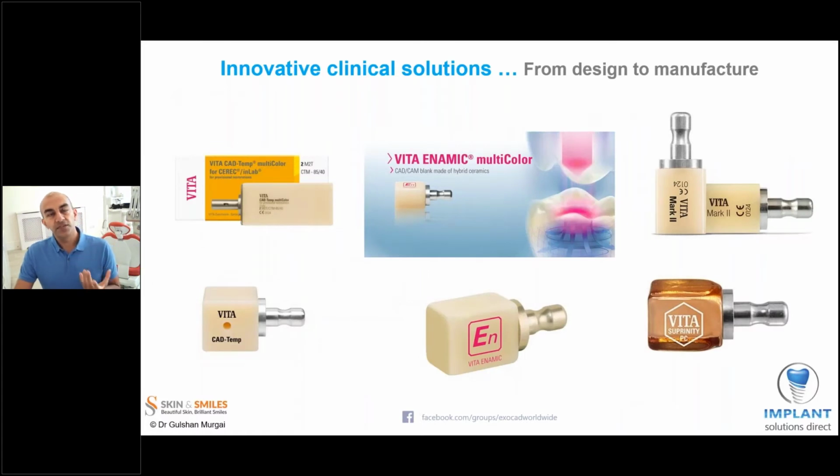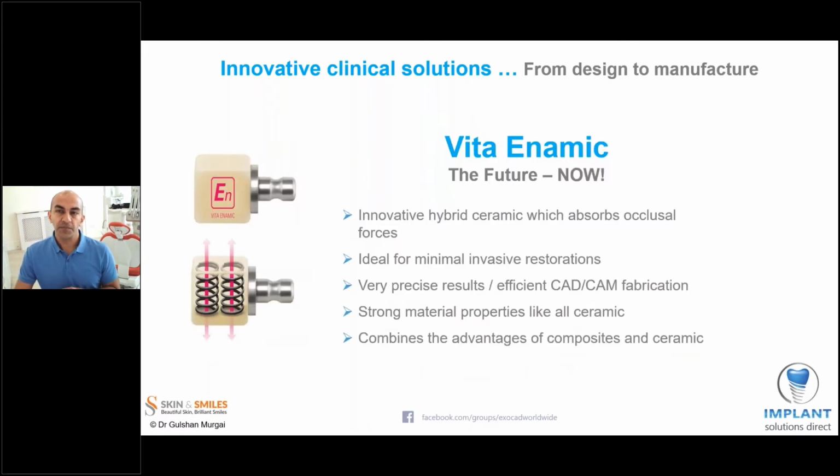Now, I personally do a lot of work with Vita. I've been using Vita's products for around about 16 years now. And here on the screen, you can see a number of their products. Enamic is their flagship product. But I also am using Vita Mark II, which is a feldspathic. They have their PMMA, which is a reinforced PMMA for long-term temporary restorations, and then Suprinity, which is a zirconia reinforced material.